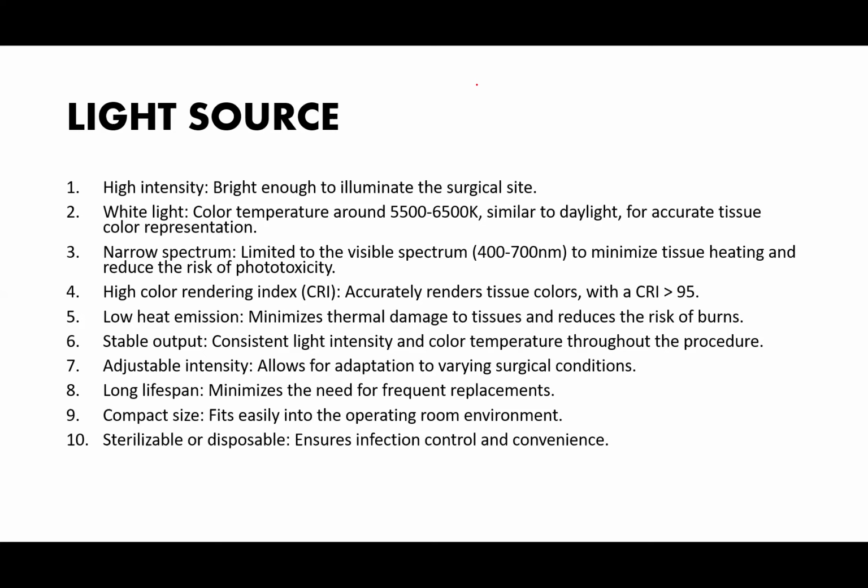So that is an excellent color rendering index. Now, it should have a low heat emission to minimize thermal damage to tissue and reduce risk of burns. It should have a stable output, shouldn't be fluctuating, with consistent light intensity and color temperature throughout the procedure.